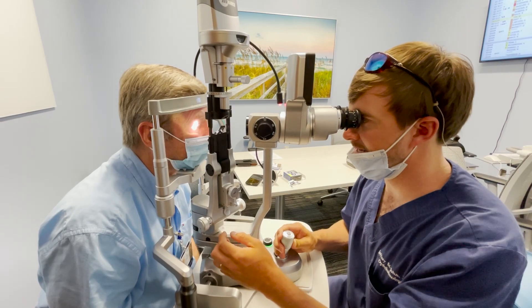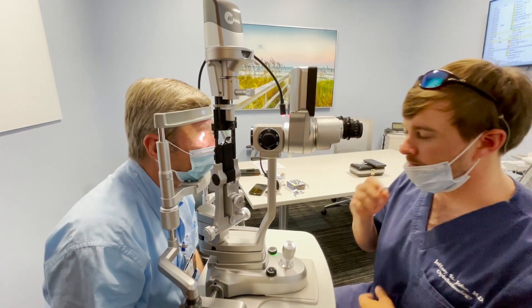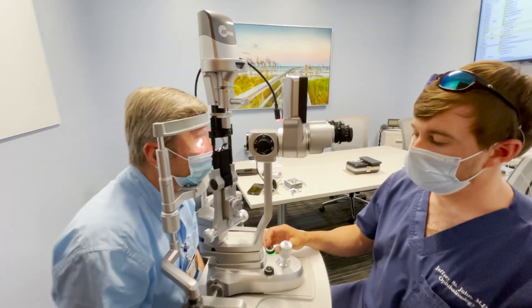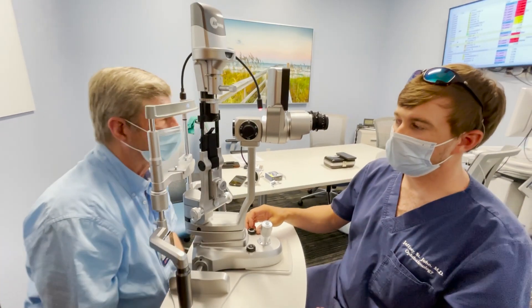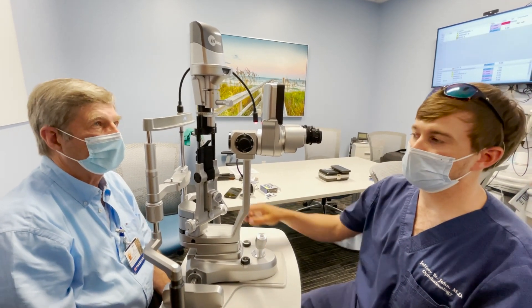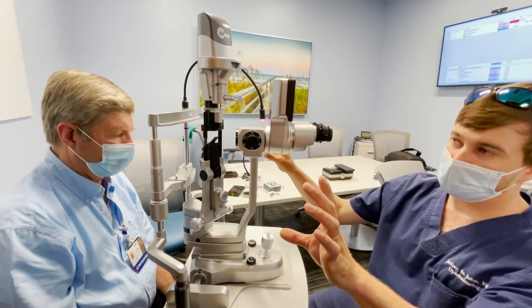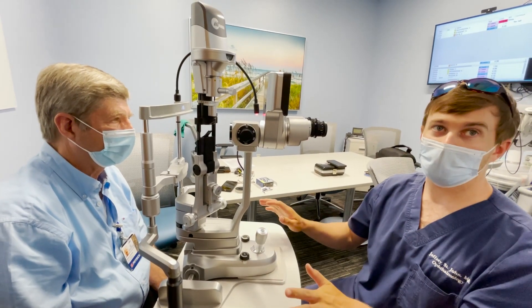For hygiene — especially when seeing patients with conjunctivitis and similar conditions — you definitely want to wipe the slit lamp down with a bleach wipe, making sure the headband and chin rest are clean. If you're touching the patient without gloves, you want to clean everything you've touched.